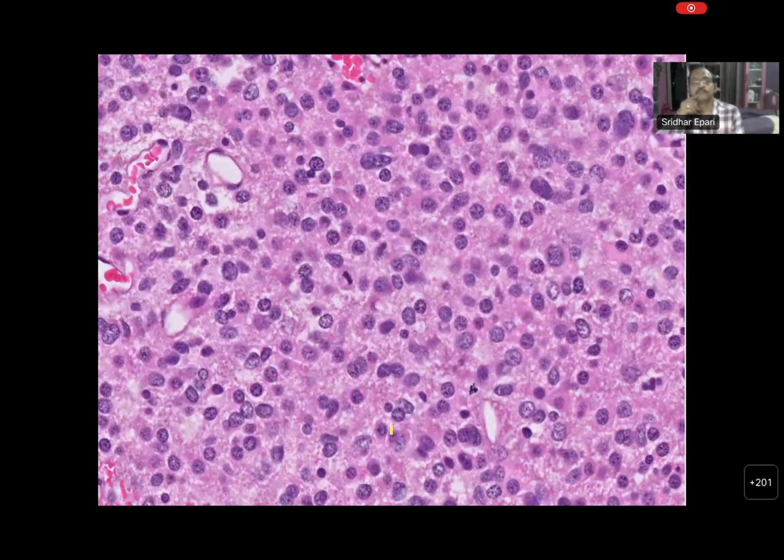Previously there was a geographical distribution of tumor cells. In this picture, there are enlarged pleomorphic astrocytes. We don't know whether they are astro or not, because they're perfectly round glial cells, but likely to be astrocytes with scant to absent cytoplasm and fine granular chromatin. Also in this picture, I can see mitotic figures. Is this the one we are talking about? Yes, sir.